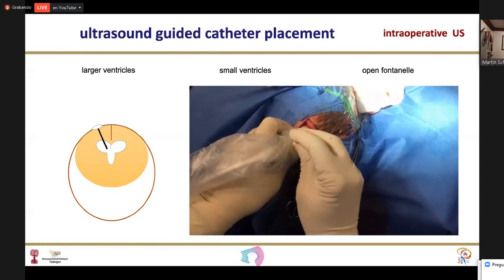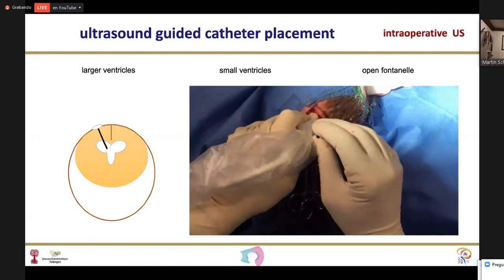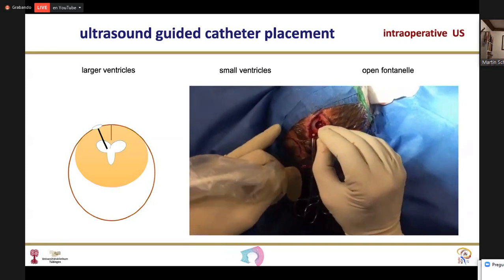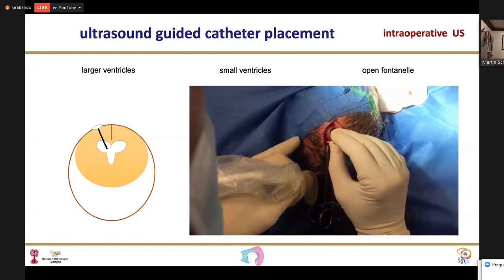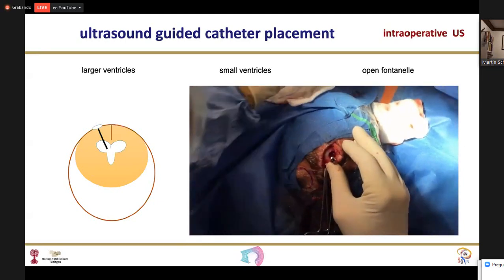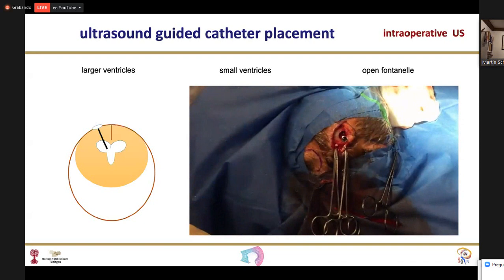We have the burr hole ultrasound. We have the brain needle. We do our scan to determine the perfect trajectory. Then I do parallel movement and slowly introduce the needle in the exact correct trajectory into the ventricle, and you see the dripping of the CSF. There's not much pressure on it, but we have a nice ventricular tap.